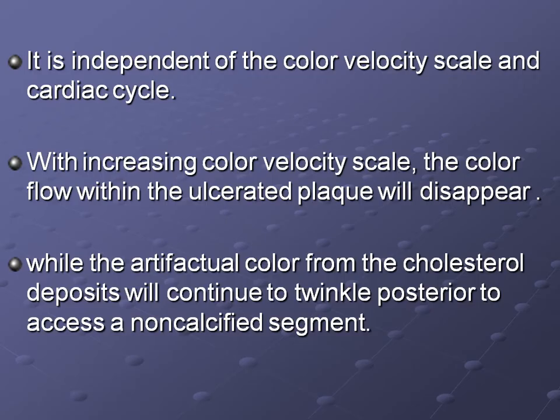Okay, it's independent of the color velocity scale and cardiac cycle. It's just there. You change the cardiac cycle, nothing happens. You change the scale, nothing happens. With increased color velocity scale, the color flow within the ulcerated plaque will disappear, while the twinkle artifact will not disappear. Okay. And the artifactual color from the cholesterol deposits will continue to twinkle posterior to an uncalcified segment.